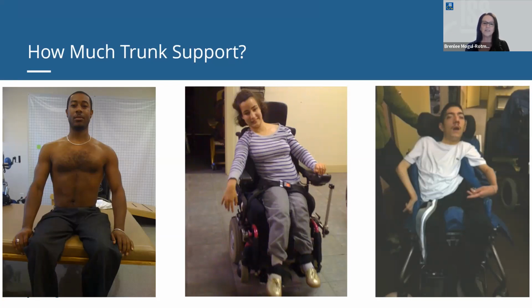She requires pretty significant support when her spasms occur. She requires support, but more minimal on the opposite side that she falls to when she's able to rest back or be positioned back into that more upright posture. So the force of what she needs is asymmetrical, and it's different on both sides.